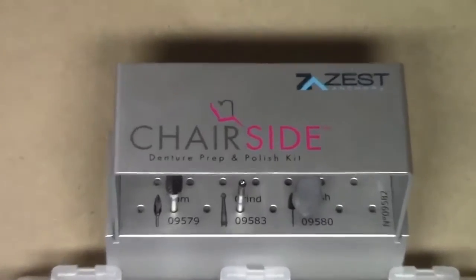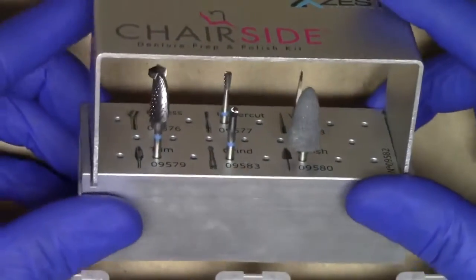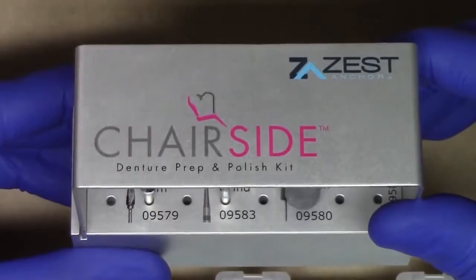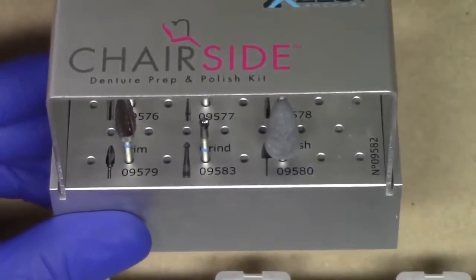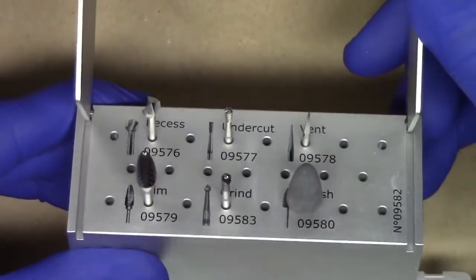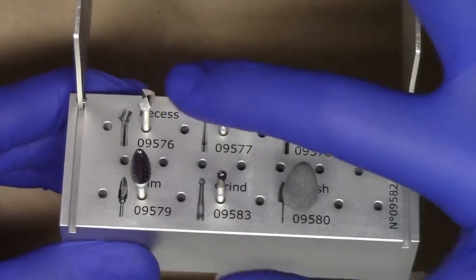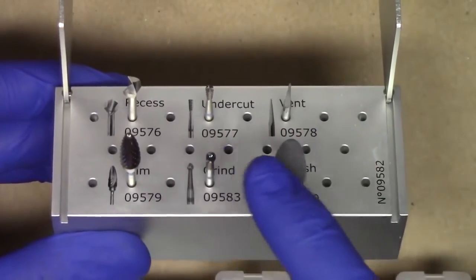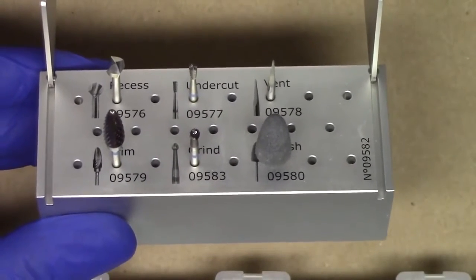As I zoom in, the first thing you'll notice is that the burr block has a very nice attractive design with a premium feel to it. Included in this burr block is everything that the clinician would need to process either a locator or Saturno denture cap into your existing complete denture. As I open the burr block, you'll notice you have six burrs of varying names and different designs. The top three burrs are your preparation burrs, and your bottom three burrs are your polishing burrs that you would use after you have attached your Saturno or locator denture cap to the denture.